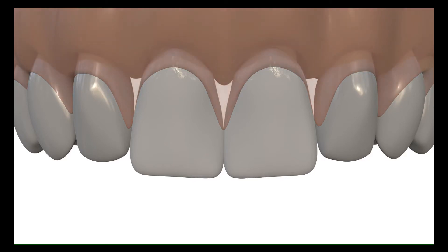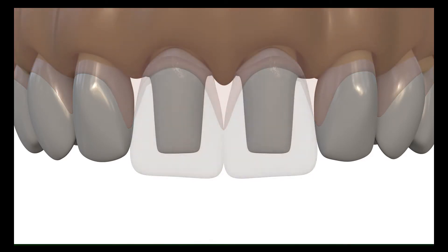We have to go through the subgingival region during preparation to make the gingival line alignment. The margin should be placed 1.5 mm below the existing gingival level to correct the 1 mm asymmetry.